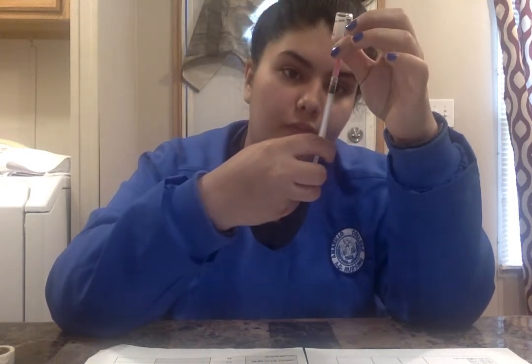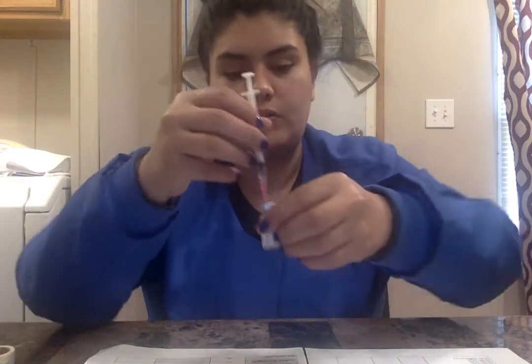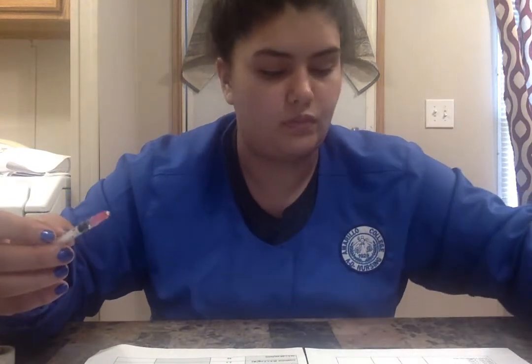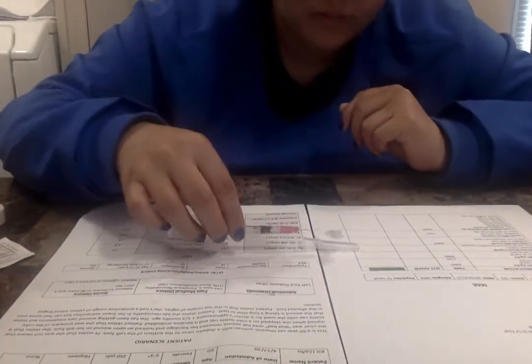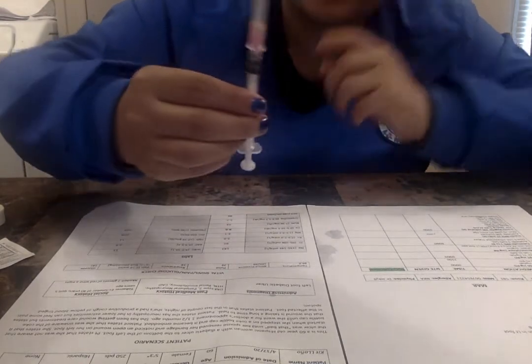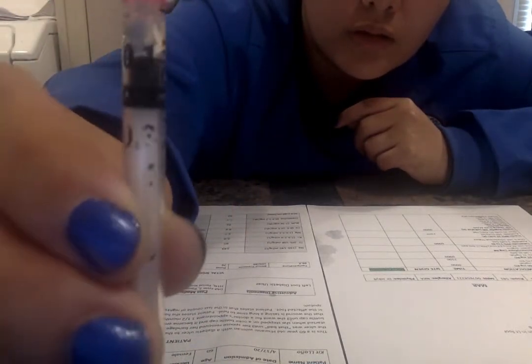So now, 0.1. I'm going to recap my needle using the swoop and scoop method. So swoop and scoop. I'm going to show you that this is 0.1 mL.